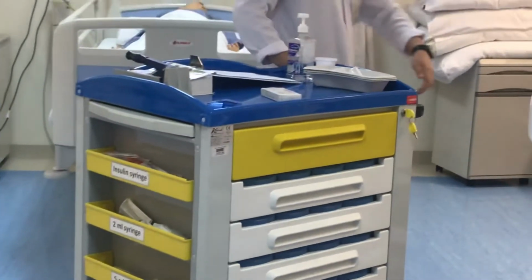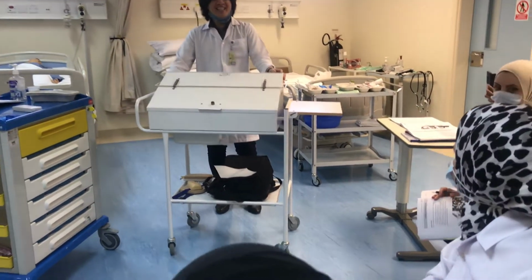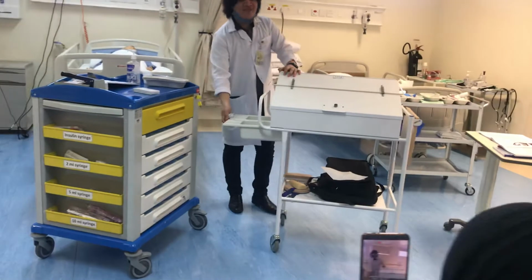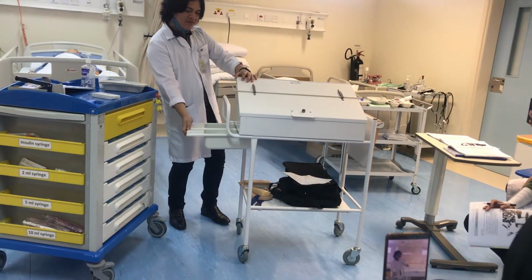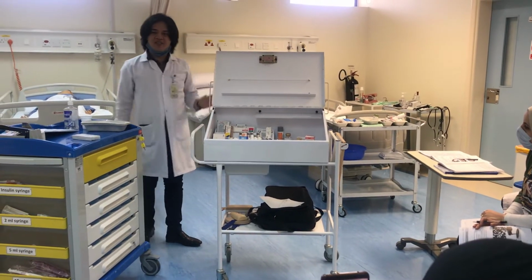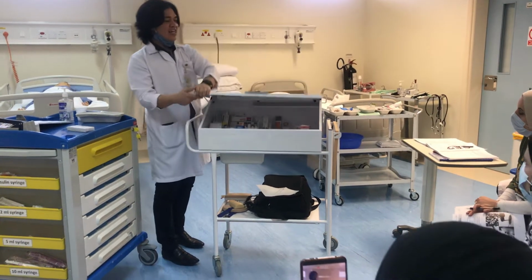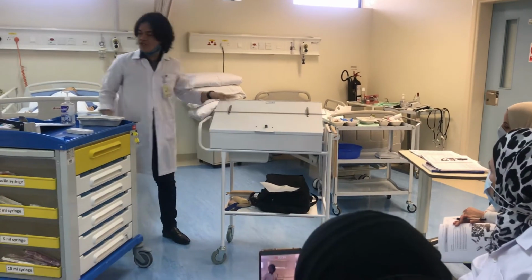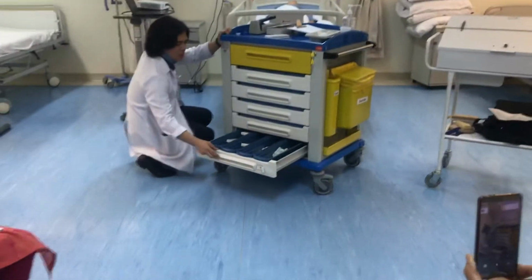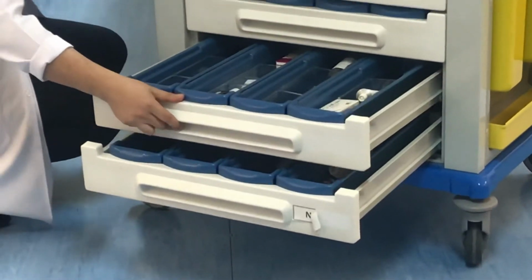Here, the old one, I think, is this one. And the syringes are here. See, it's very traditional, but I like this one. You can just put it like that. And the prescriptions are on top there. And other things, ma'am, like needles, cottons, etc. Just get yourself familiar with these things.